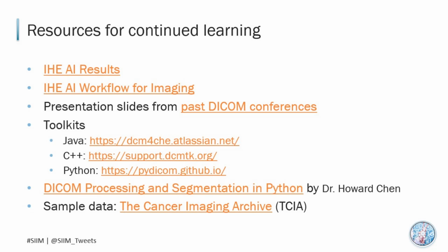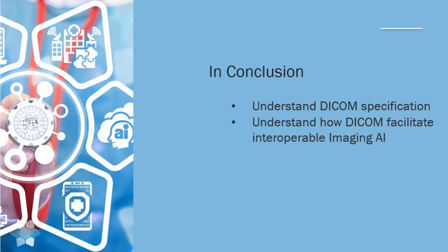Oh, awesome. Thank you. Now, tell me, what have you learned today? Oh gosh. All right, let's see. So DICOM is a broad standard documented in many different parts, which details what a valid DICOM object means, as well as how to communicate the various DICOM objects. And DICOM has rich support for imaging AI on both the input and the output of an AI model.